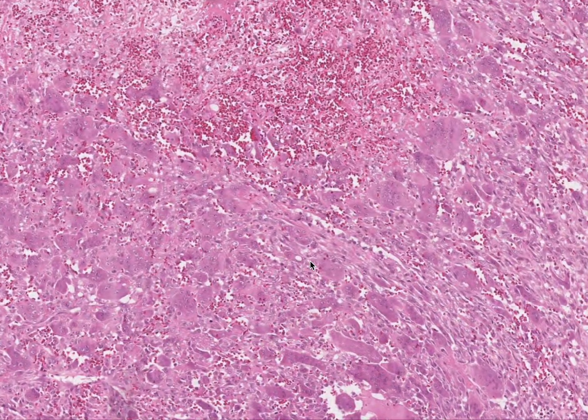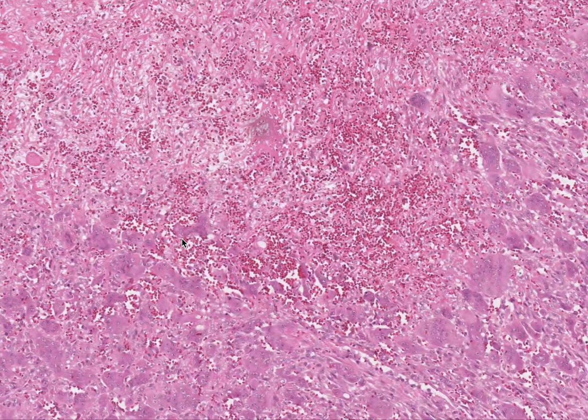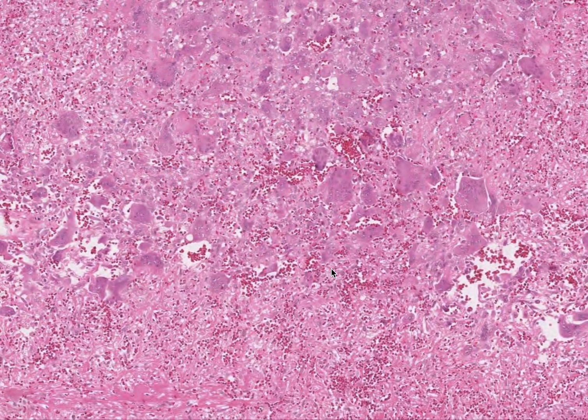As I always say, the first impression should be made on a scanner view. In scanner view — I'm using this cursor to point — I'm having areas of hemorrhage here and there, and I do have lots of cellularity. Let's zoom in a little bit and see what they actually are. Yes, whatever we thought as hemorrhages are hemorrhages. I do see some acellular areas and I do have cellularity.